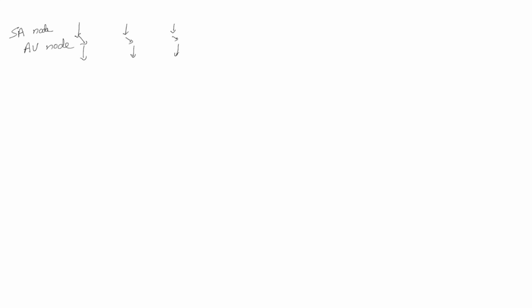Now notice that the intervals between the P waves is relatively constant, and the P waves all look similar. So that's my best attempt at drawing something that's similar. Now, something might happen in the atria. There might be another irritable focus that fires off before it's supposed to fire. So you would have a weird looking P wave. So let's go ahead and draw it like that. And notice that it happens before you would expect the next wave.